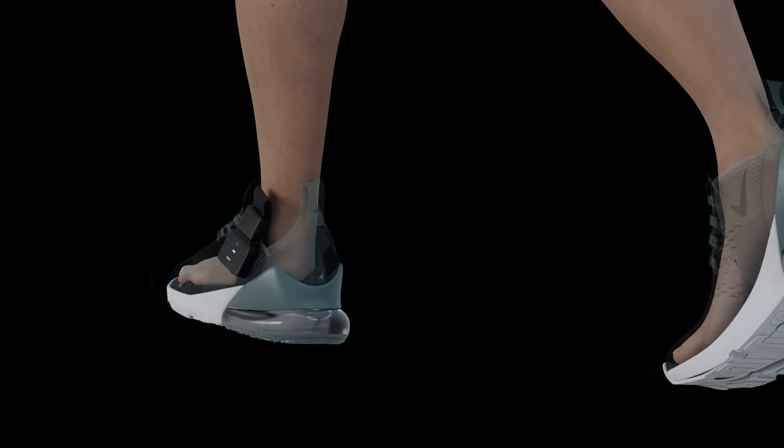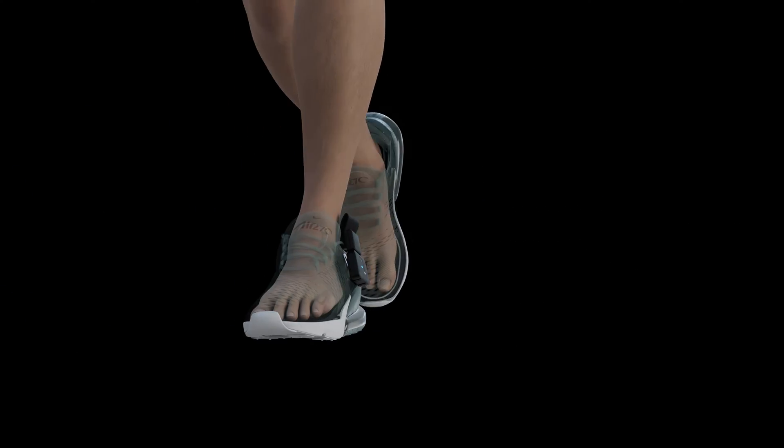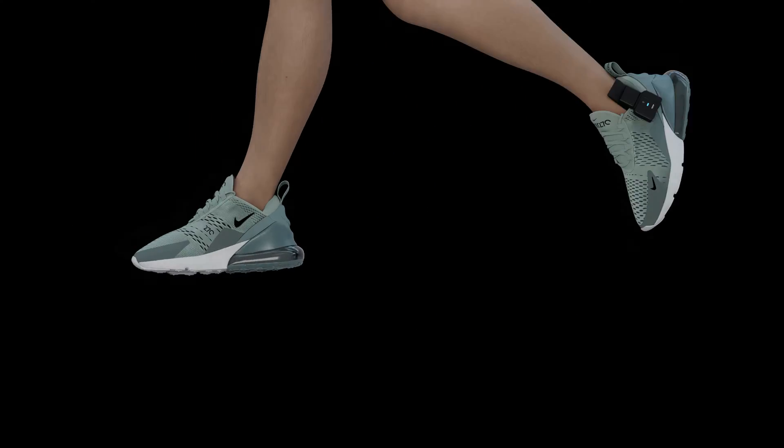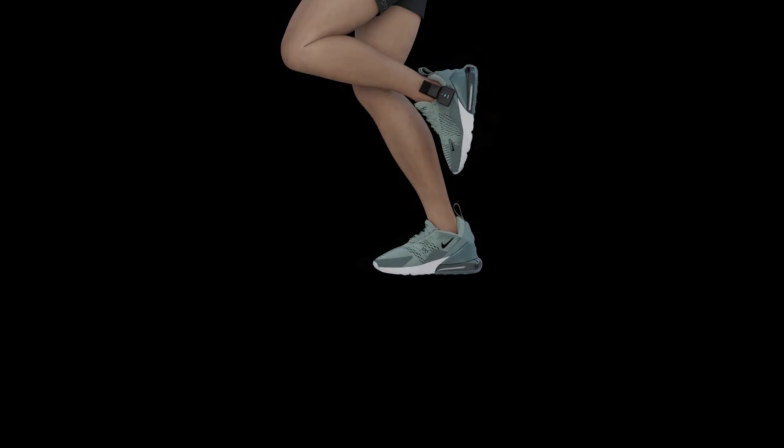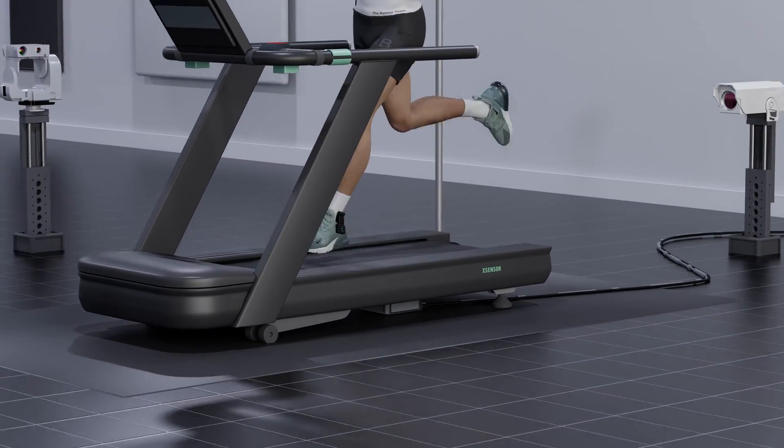The intelligent insoles reveal accurate plantar pressure data to help biomechanics professionals, clinicians, and researchers optimize human performance, improve foot function and gait, and reduce the risk of lower extremity injuries.